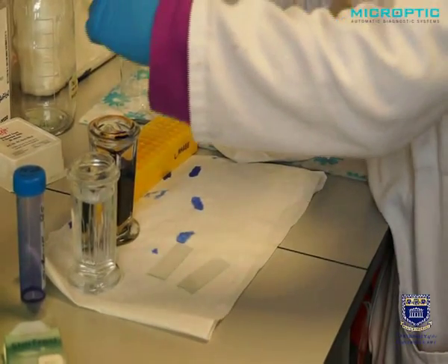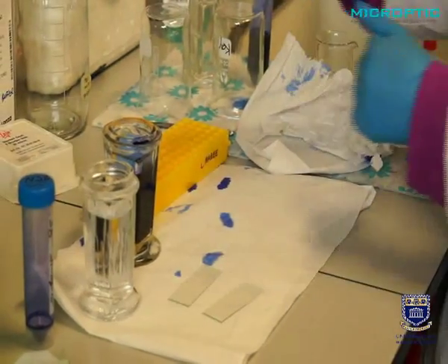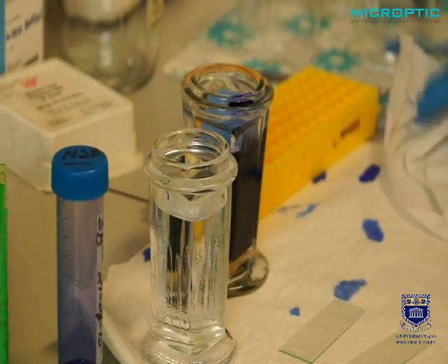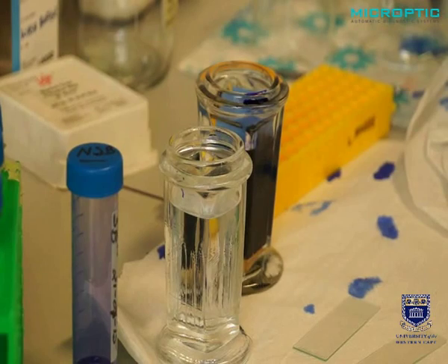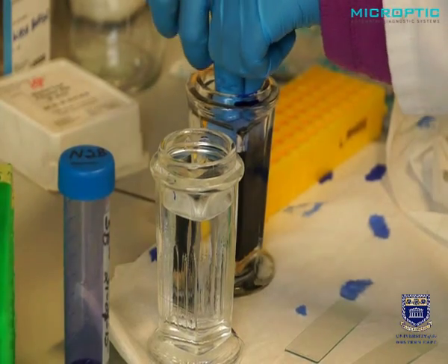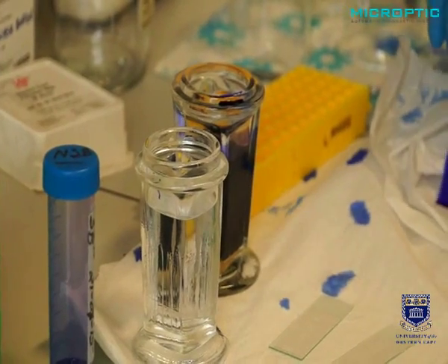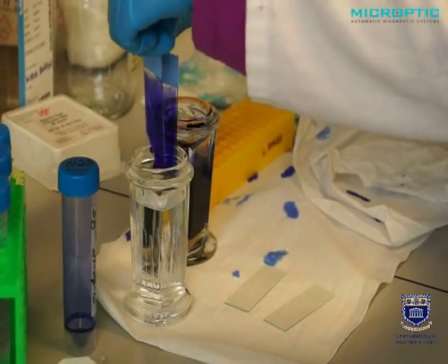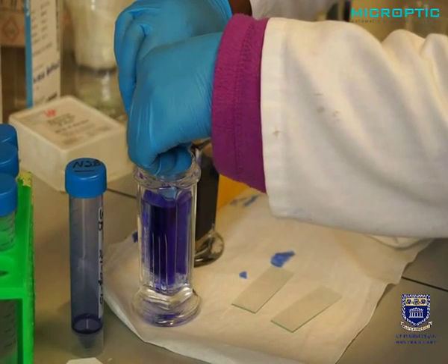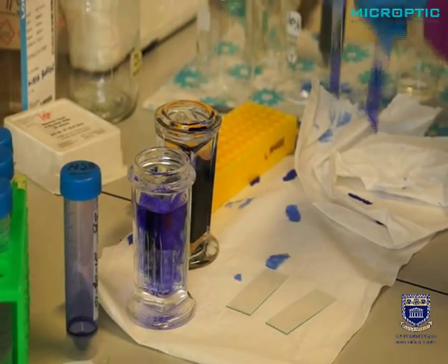Okay, Asanele now puts the slides into the Sperm Blue, which is at room temperature, and we leave it there for exactly 45 seconds. While we're not going to do it now and just demonstrate the technique, after 45 seconds she will remove the slides. You can remove the slides, drip dry them on filter paper, and now you can insert it in distilled water for 1, 2, 3, 4, 5, 6 seconds. Slowly pull them out.